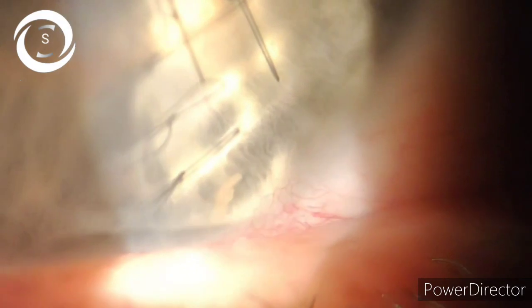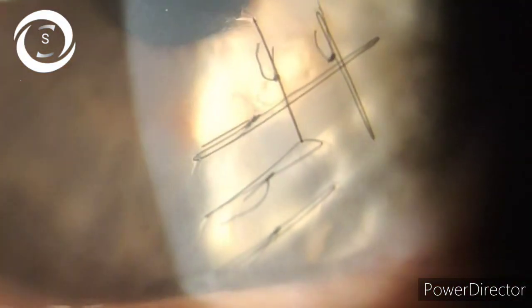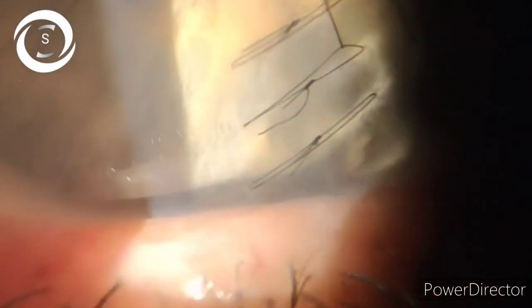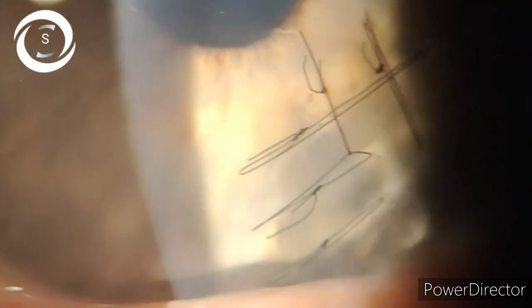His vision was 6/24. The pupil was round, you can see the pupil is round, regular, and reactive. The 6/24 vision is due to astigmatism. The astigmatism is due to sutures as well as the traumatic corneal scar, but I am hopeful that it will further improve to 6/6 after the removal of sutures.